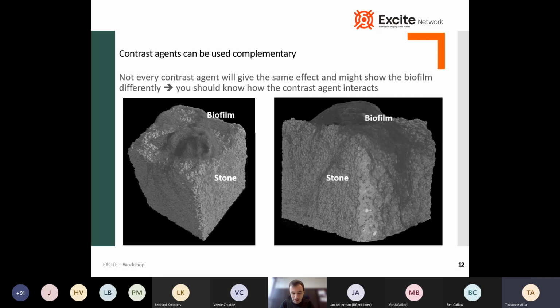What's also important to think about is that not every contrast agent gives the same effects. In my case, some contrast agents show my biofilm differently. That's caused because the contrast agent does not necessarily bind to the same feature of the biofilm. This was shown in this example, where I imaged cyanobacteria which were covering a stone. These were stained with two contrast agents, A and B, which are left and right. What you can see is that on the left, you see much more detail compared to the contrast agent used on the right. And this is actually the same biofilm, so it shows that they probably get attached to something different. So that's something you should take into account.